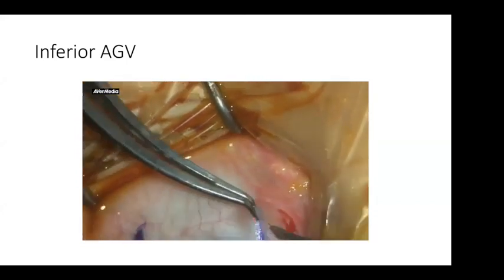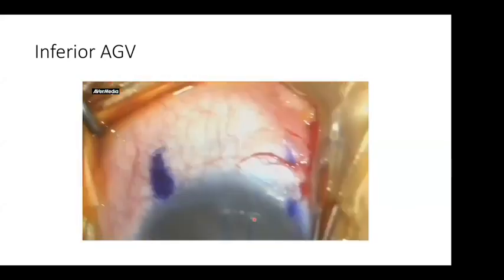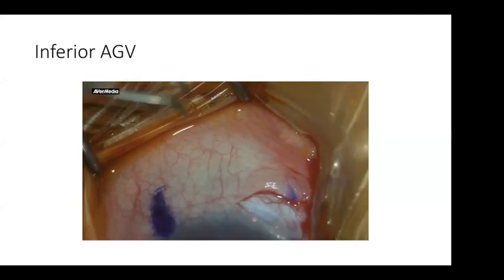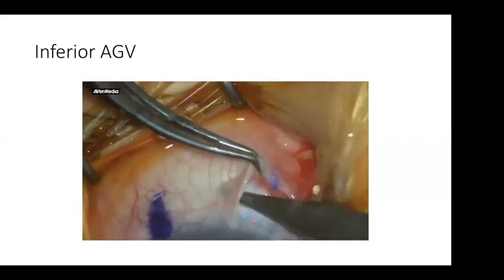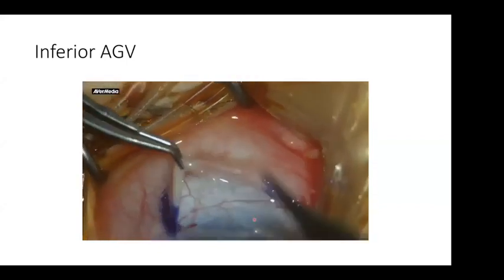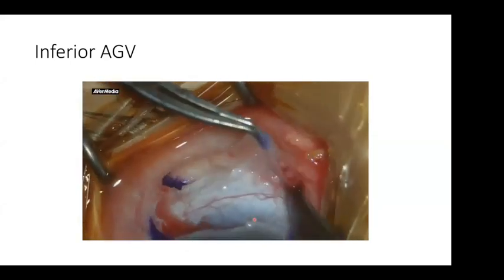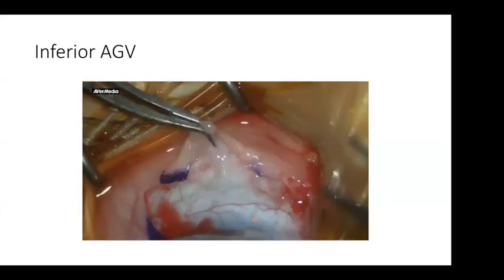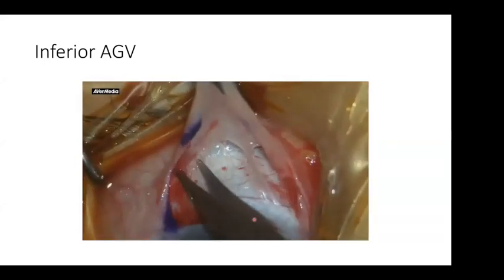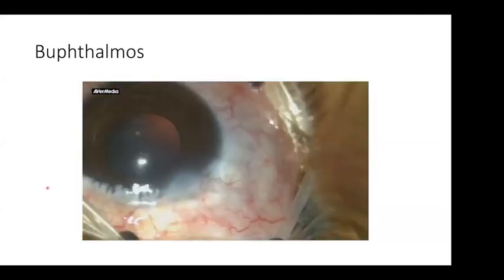But again, I'm just showing you that we can face some difficulties that can compel us to change the area of implantation. If I notice this preoperatively, it was not very obvious, by the way, but under anesthesia, I could see this clearly. I did not open the conjunctiva over it. I just dissected the inferior, and it is the same procedure applied for a superior placed one.